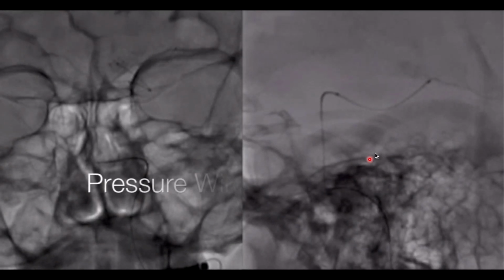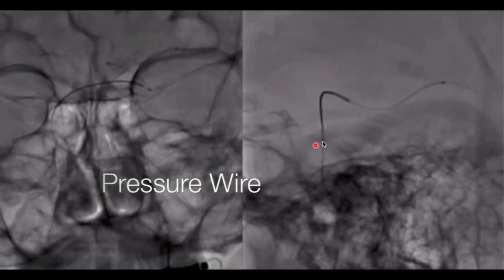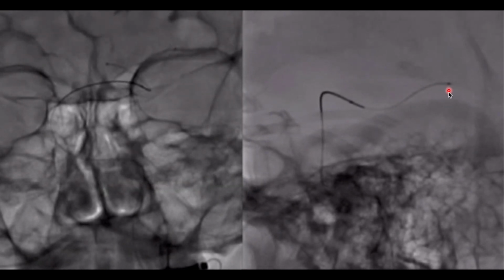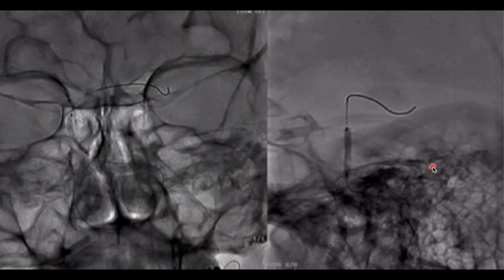So what they've done is they've crossed the lesion with a microcatheter. Now they've taken a check injection through the microcatheter, and now they've taken their wire out and replaced it with a pressure wire. The FFR wire is going in, and then the microcatheter is taken out. They do the pressure reading of the stenosis, and then they do a submaximal balloon angioplasty.